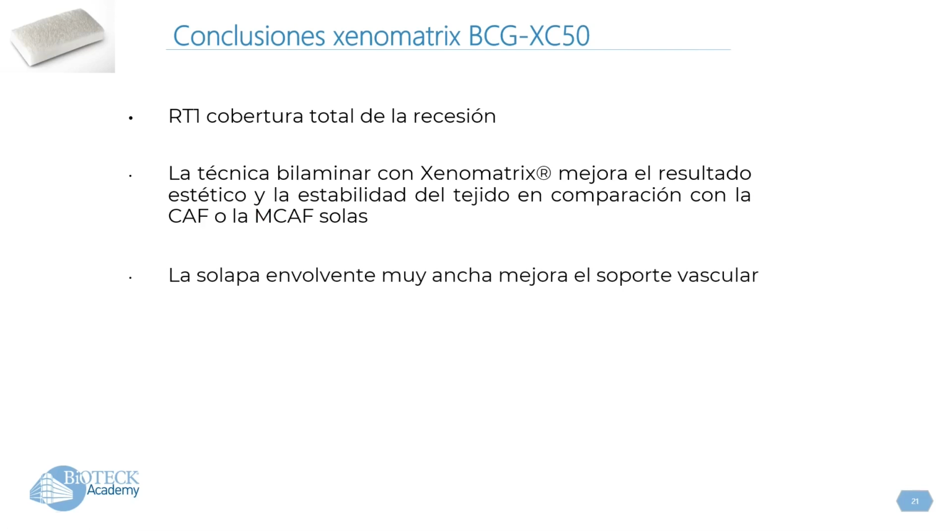There is an improvement of the vascularization, which of course becomes better for the healing of the recession. At the end also the aesthetic result is optimal, as we have seen. There is also the increase in the thickness of the soft tissues, resulting also in a healthier gingiva.